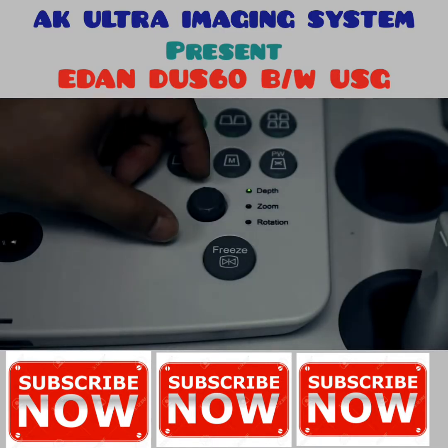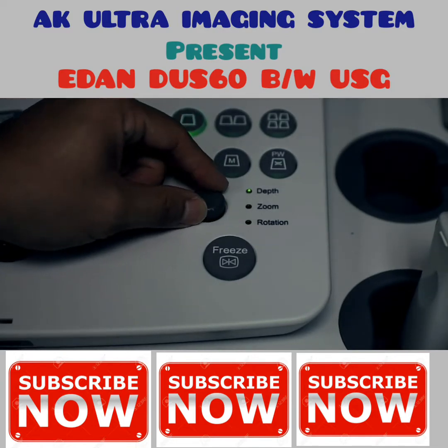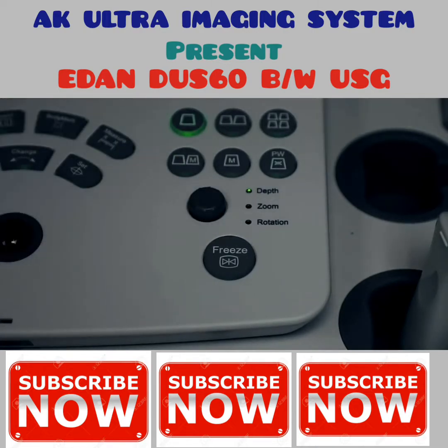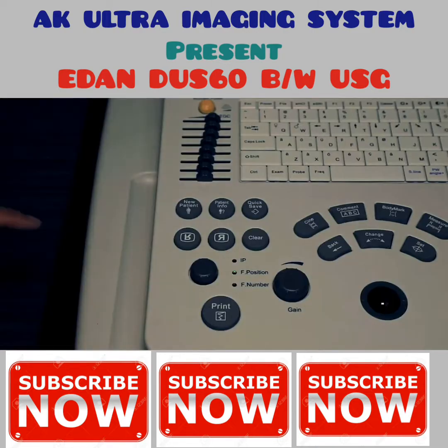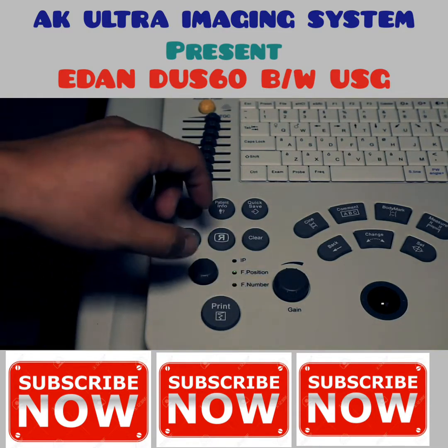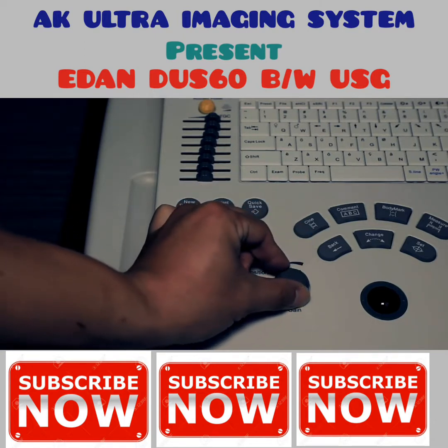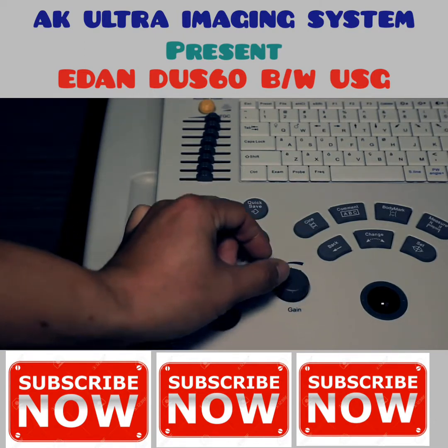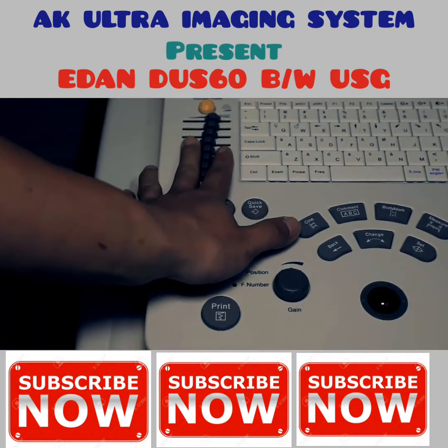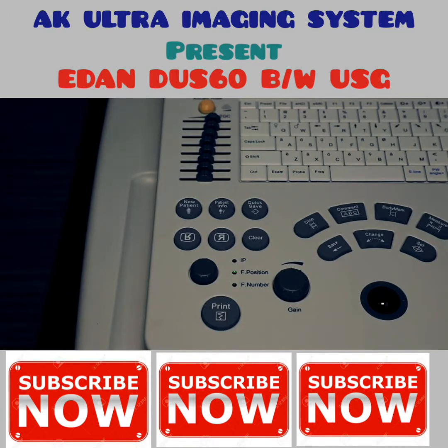To adjust depth, turn the knob — the area of interest should be in the center of your image. Gain consists of overall gain and TGCs. To adjust overall gain, turn the gain knob to make sure the image is not too bright or too dark. Then adjust TGCs from top to bottom; the goal is to keep uniformity of brightness.